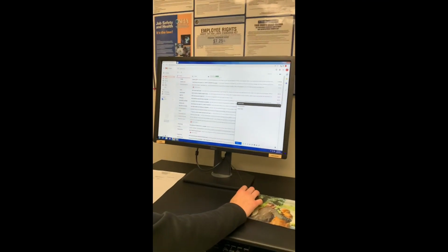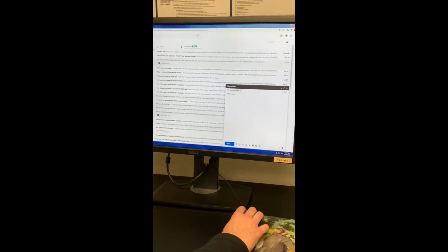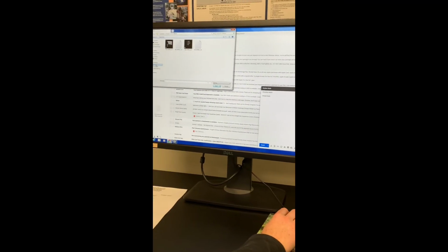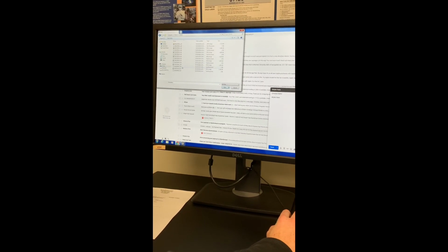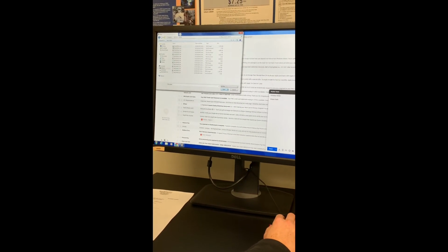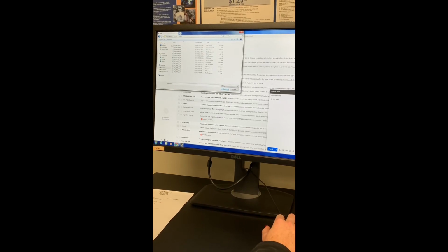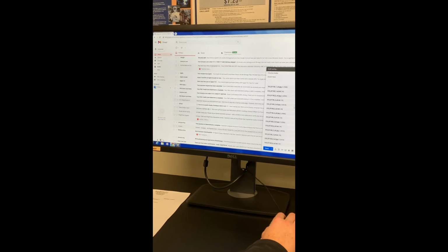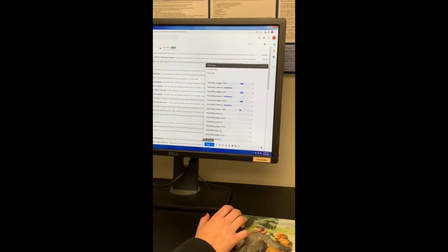I've already pulled up the clinic email and placed in my name to send my rads to myself. I can then go to the attached file and click on the OS, click on his name and select all of them, open, and then I'll send them whenever they all load.